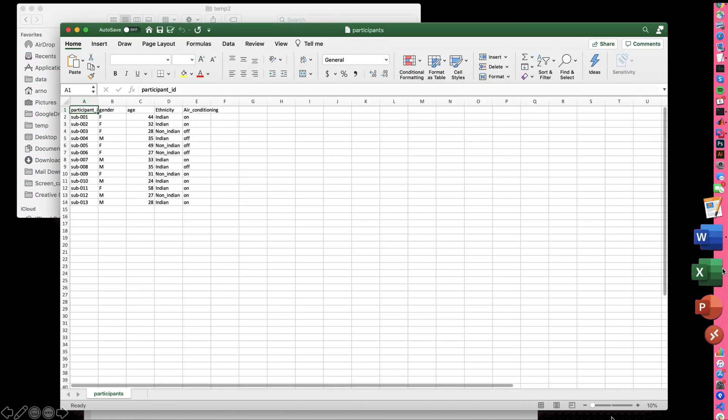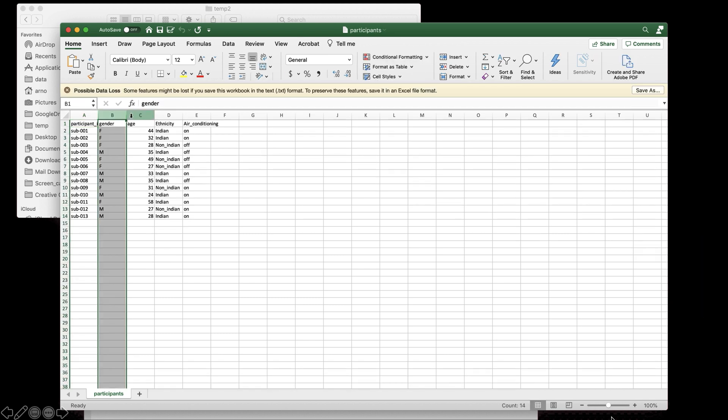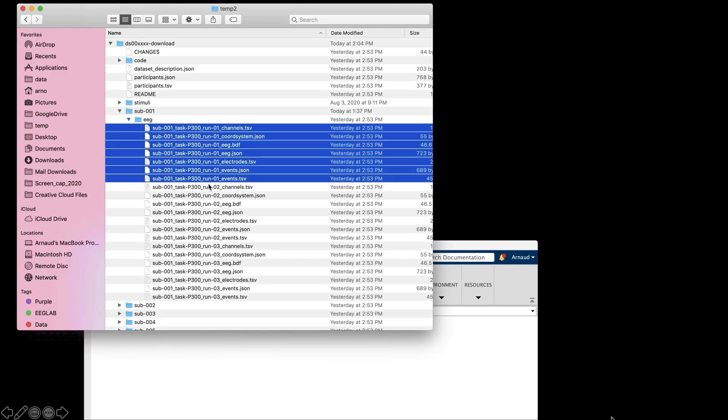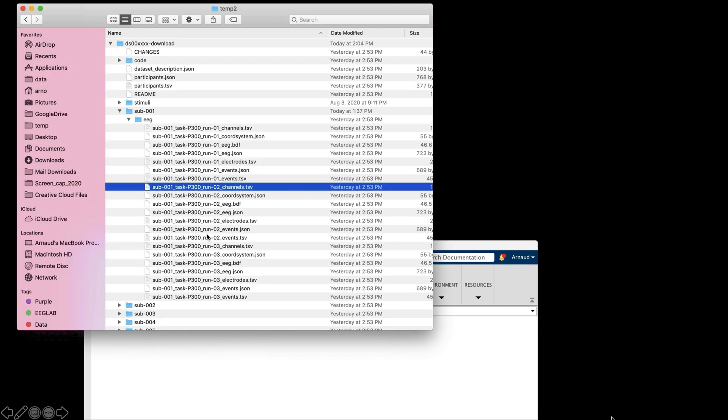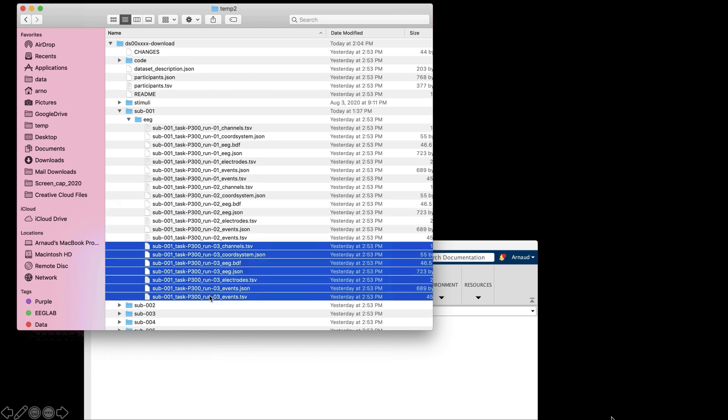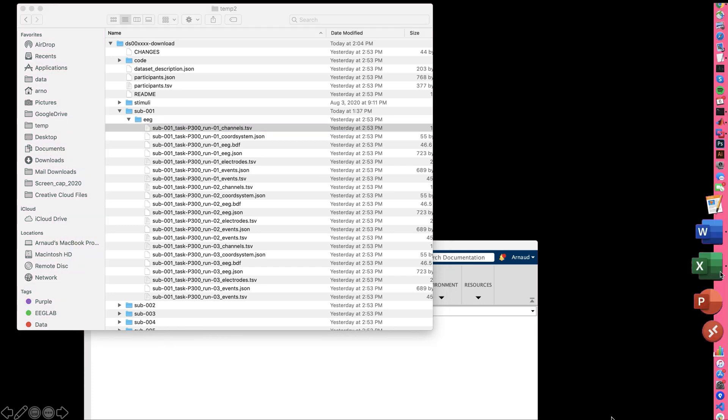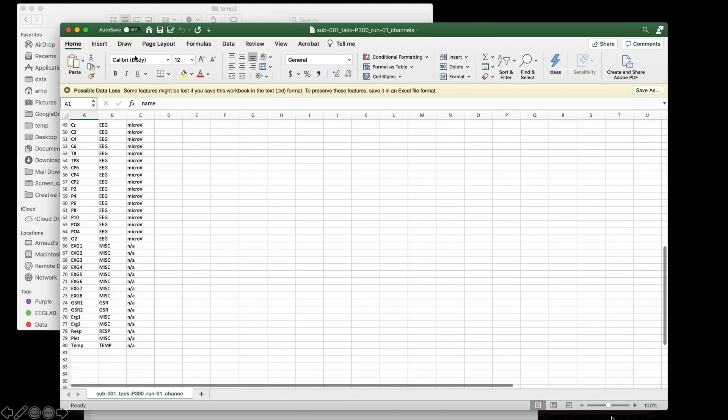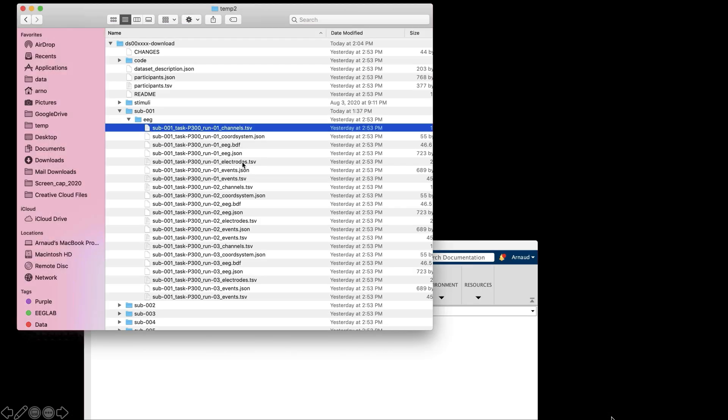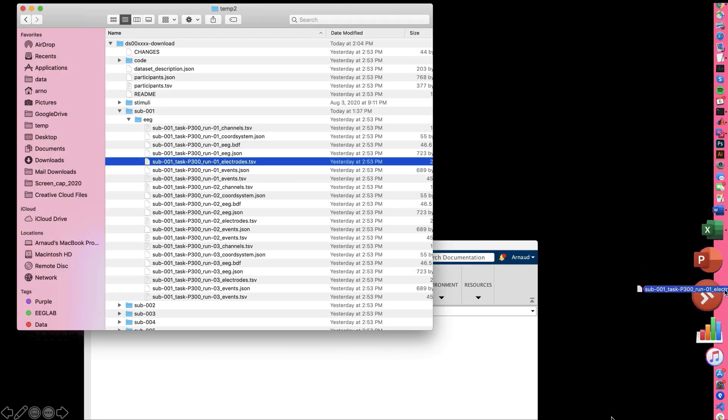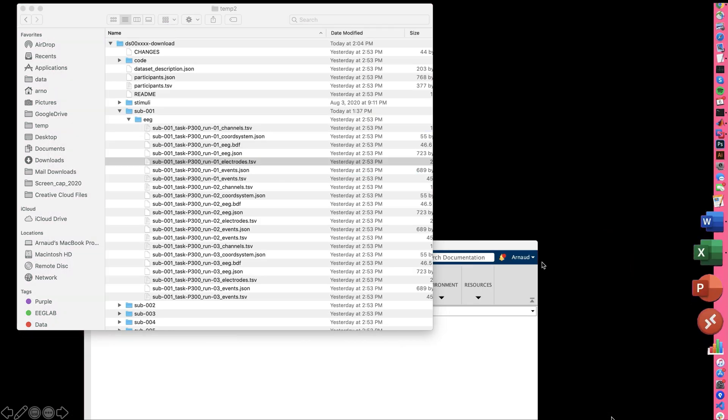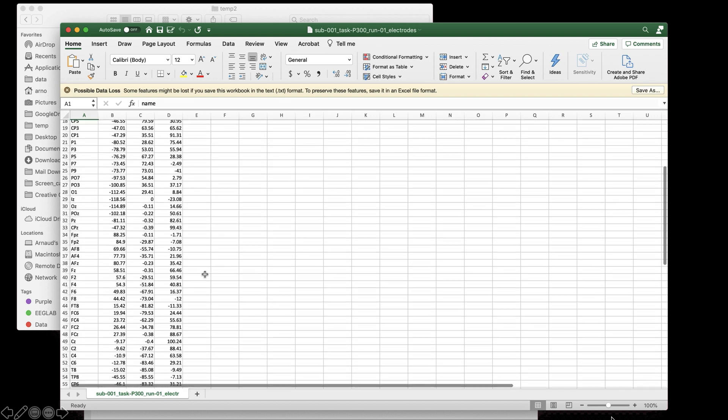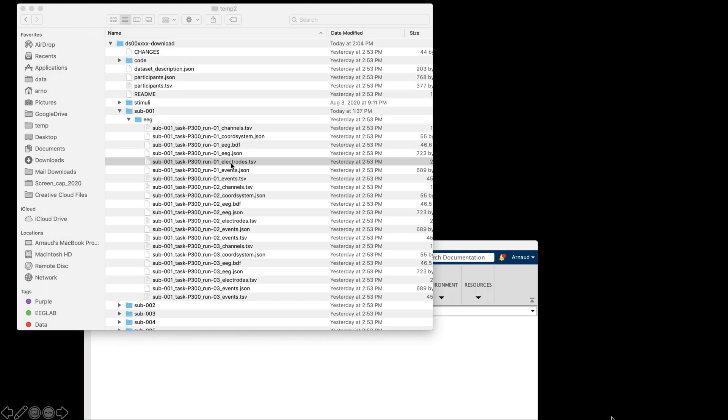First, the participant.tsv contains gender, age column, and one row per participant. Then we have the subject folder and EEG subfolder. So here we have three runs, so three sets of files. We're just going to look at one of the sets. For example, the channel file, which contains channel labels and channel types. And then we have the electrode file, which contains the coordinates. If you want to know why there are different files, you can look at the other BIDS video, the first of this series.